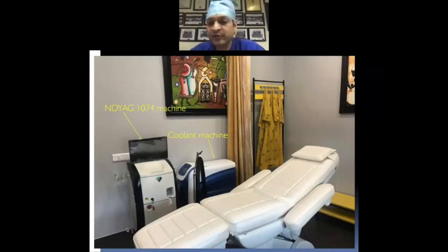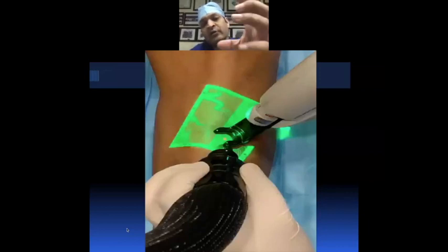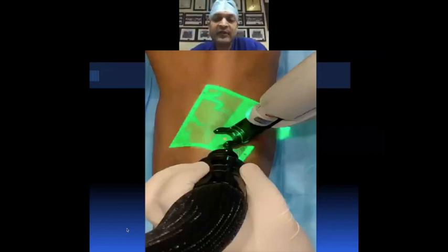So this is our hospital setup in our clinic here, and you can see we are using three techniques, three things. One is the Nd:YAG laser, which is on my right hand with a red spot. Then we are using a coolant so that there is no damage to the skin from the laser heat energy. And third is the transillumination. So we are using the vein viewer by which we can see the veins which we cannot see by naked eyes. So that's basically three things which we are doing here.